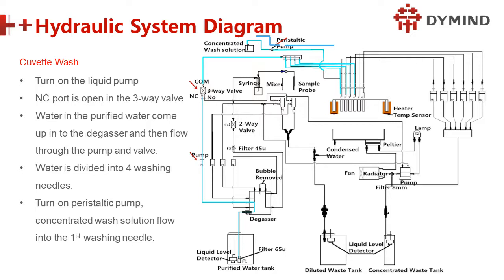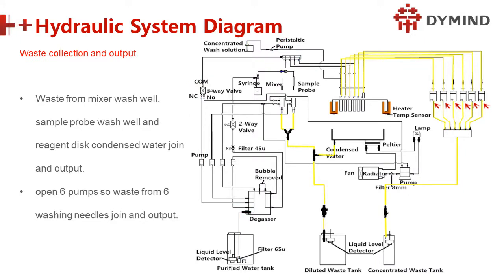Yeah, right. So this is the procedure, and also in the first wash, we have to wash many times, right? So in the first wash, the concentration will enter inside, and then the soaking and the wash cleaning. Okay. This is the waste water collection and output from here. Oh, you got it. Easy to understand.